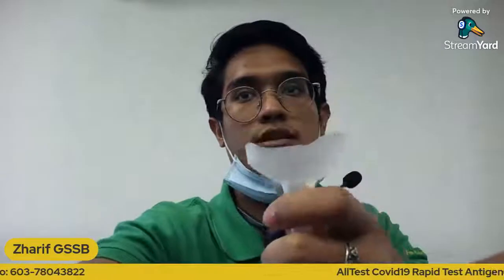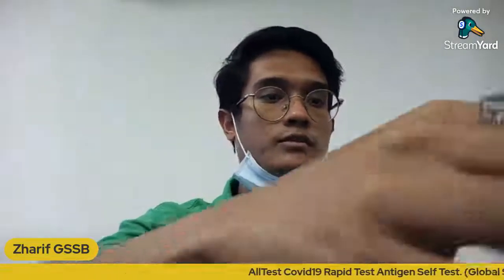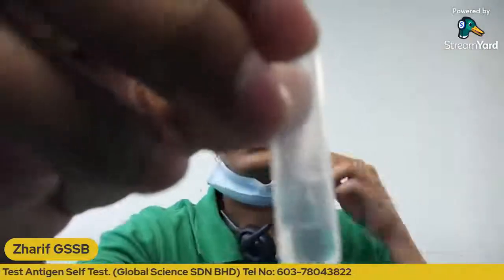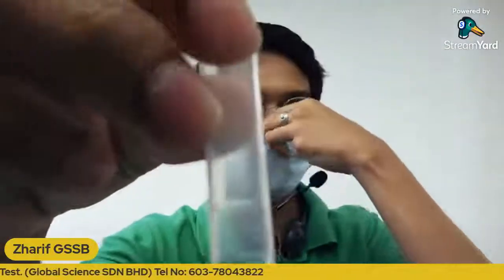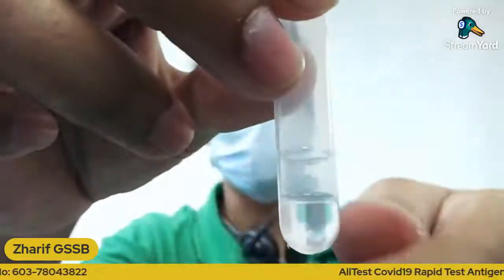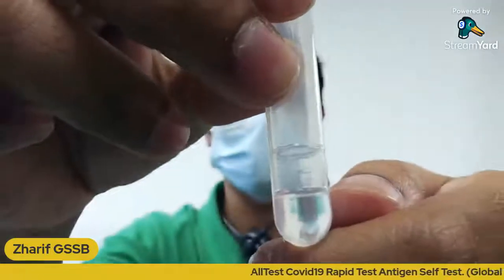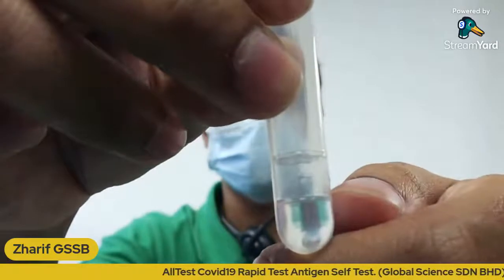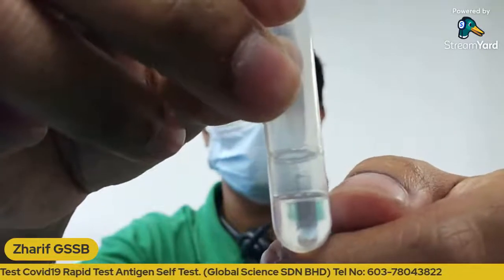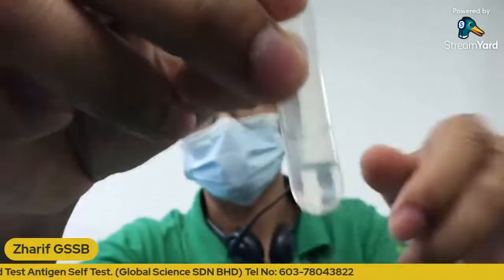Once you're done, you can remove the funnel from the tube, and it will look like this. If you look closely over here, make sure the saliva is around the first scale. And if your sample produces any bubbles, make sure the bubbles are above the line, so that below the line is only pure saliva.